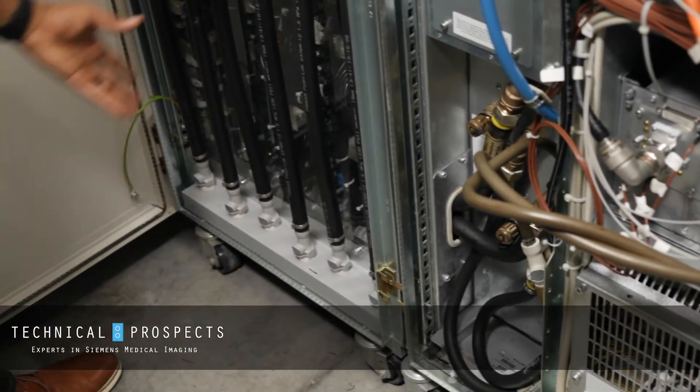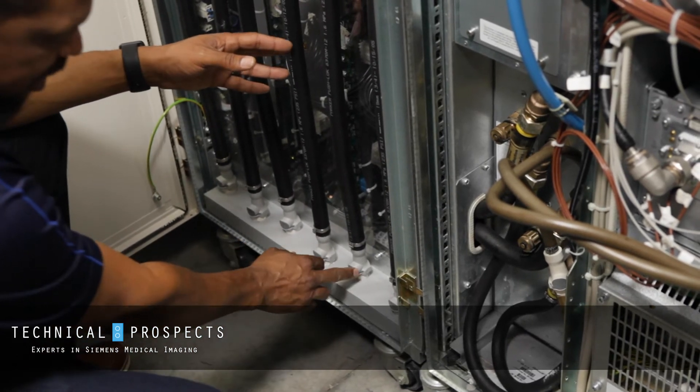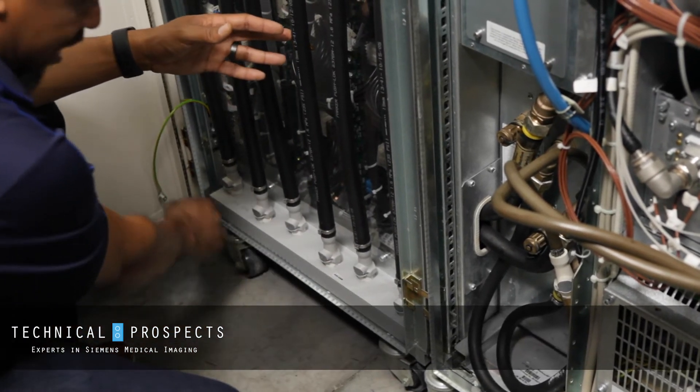Now we'll come here to our gradient cabinet and we'll do the same thing. We'll check for signs of a leak or any cracks in either one of these fittings and or the manifold itself.